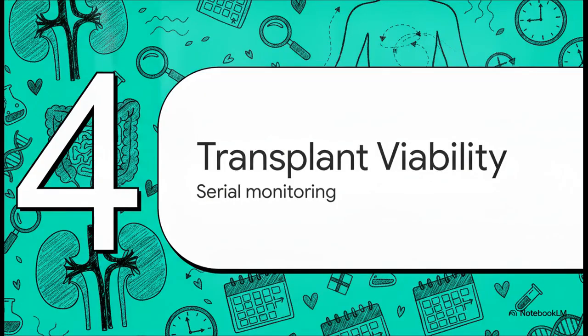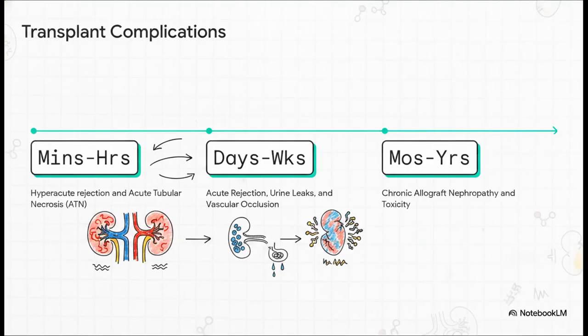Moving into Section 4, Evaluating Transplant Viability. When it comes to transplants, timing is quite literally everything. Depending on when we do the scan, the potential complications shift dramatically. In those first few minutes to hours post-op, our immediate threats are hyperacute rejection or acute tubular necrosis.